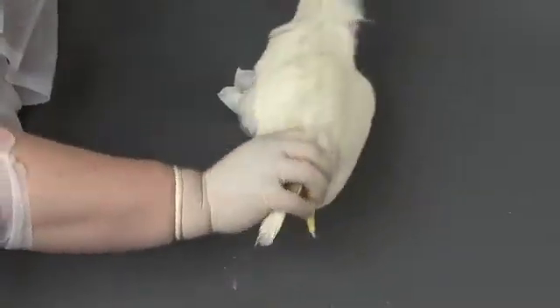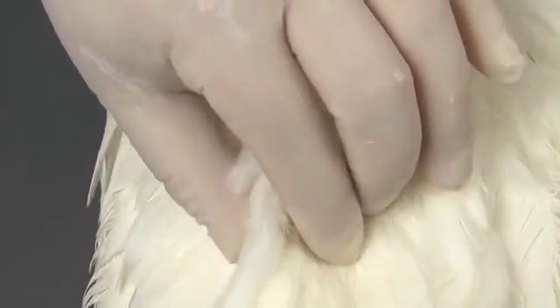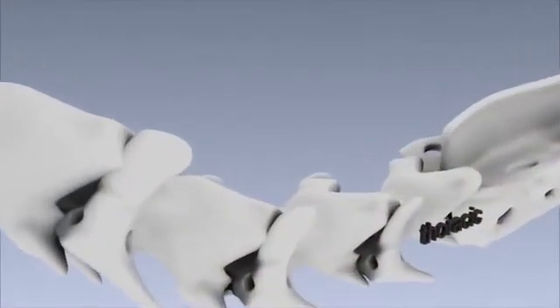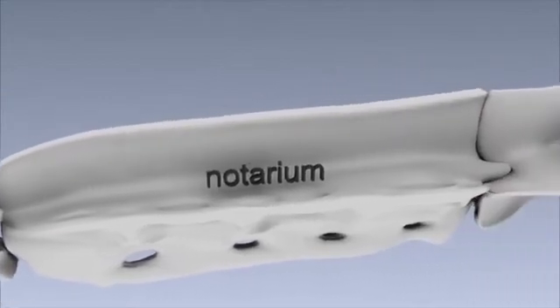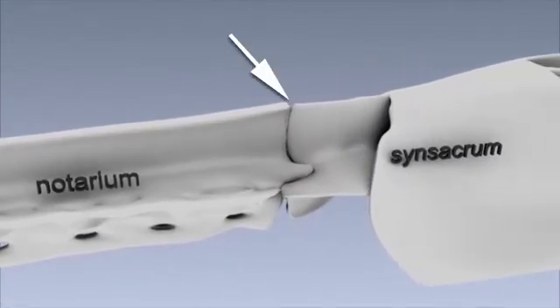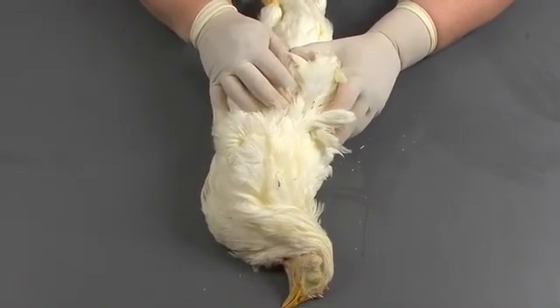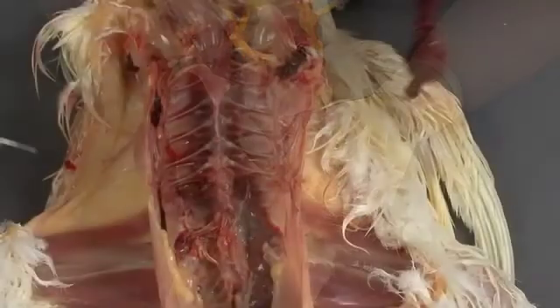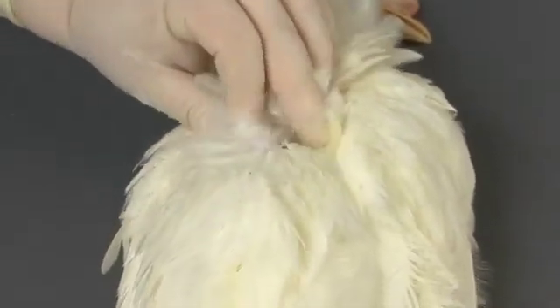Turn the bird over and palpate the vertebral column, feeling for fractures and developmental defects, such as spondylolisthesis, often referred to as kinky back. The vertebrae in birds are largely fused, and there should be little flexibility along the back. There are one or two free vertebrae located between the notarium and the synsacrum. Palpate this area carefully for fractures or deviations. This area can be examined more carefully from the ventral aspect once the bird has been opened and the viscera removed.